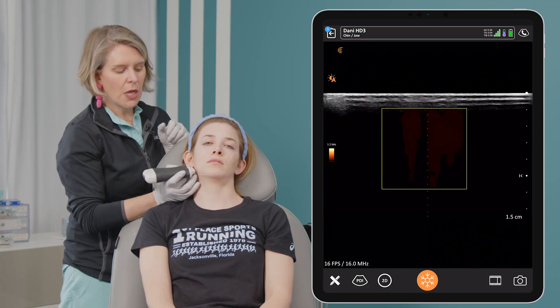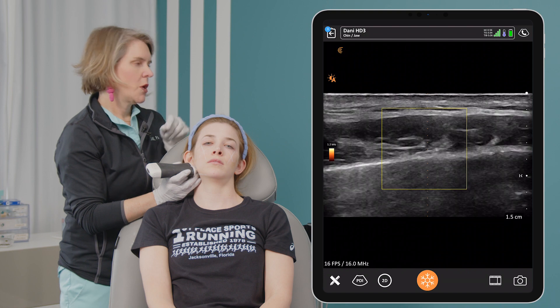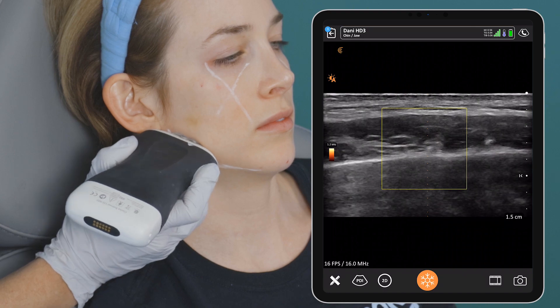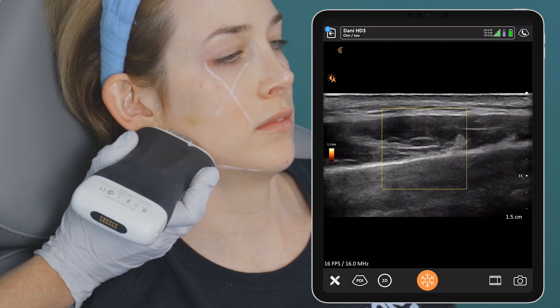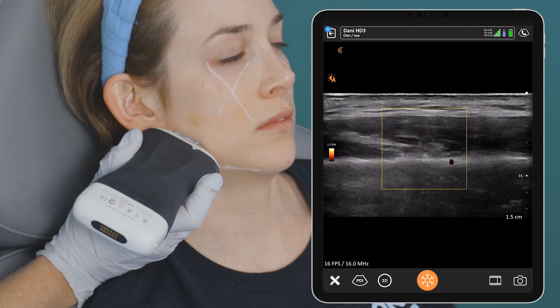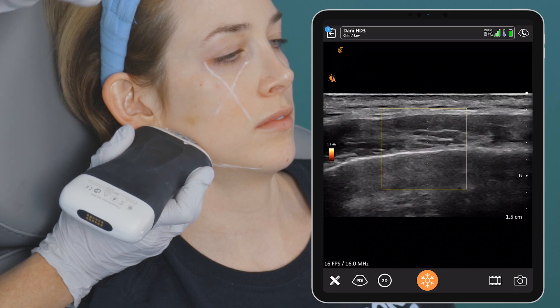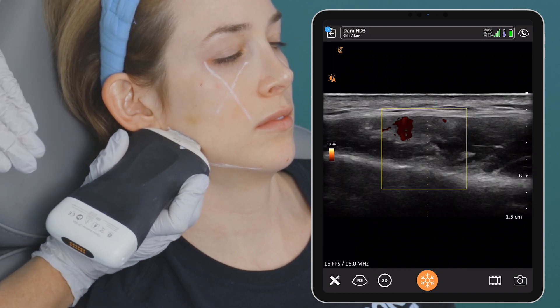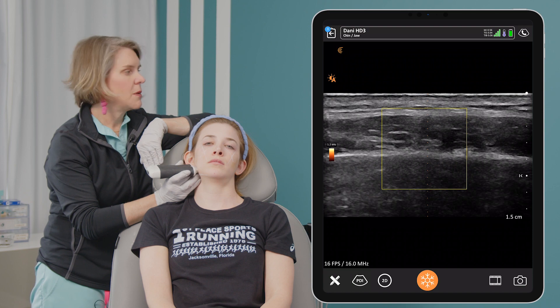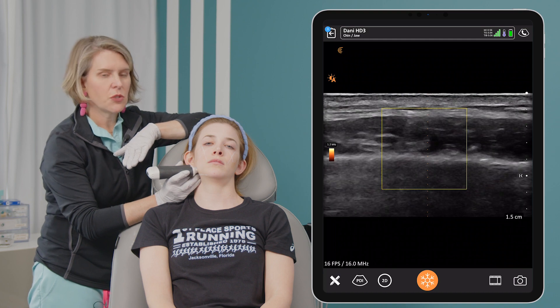The next thing is alignment — are you aligned directly over that spot you're looking at? Remember, this hatch mark is just the thickness of a tongue depressor, so we want to be very precise. Then there's rotation: we rotate to see how that looks. And then our tilt — we take a tilt up and a tilt down. The tilt is important because of your angle of incidence; it's really a 90-degree check. 90 degrees in one direction is different than 90 degrees the other way. You want to go at the same exact angle that you anticipate injecting, so picture your syringe along this same plane of injection.